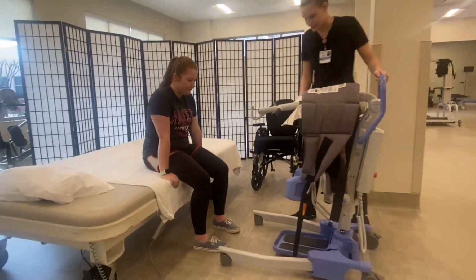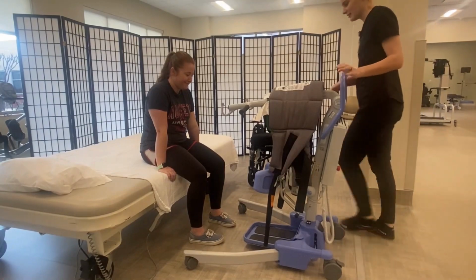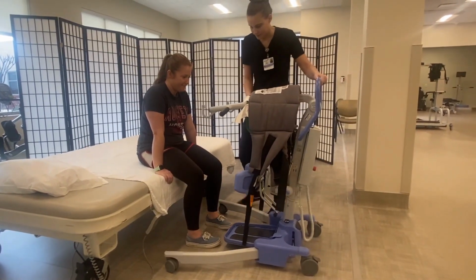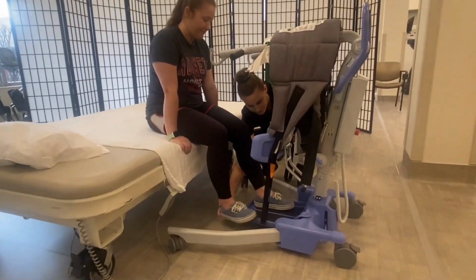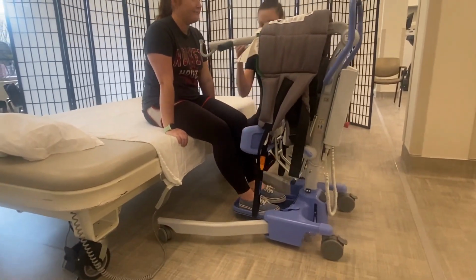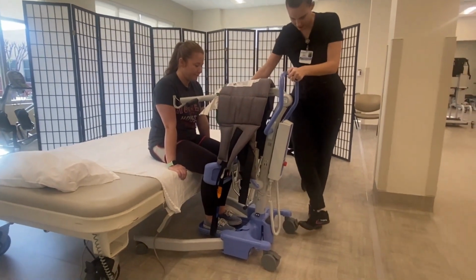When using the battery-powered lifts, the patient starts in a sitting position with or without minimal stabilizing support from a healthcare worker. The harness is fastened to the patient and tightened as the lift is placed in front of the patient, then locked, and their feet are placed on the foot plates.